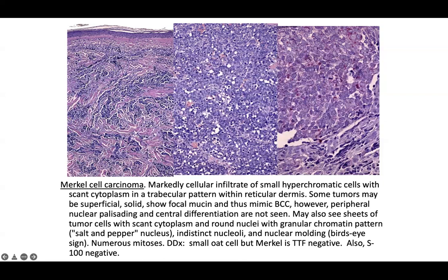You can see mucin, nodular and superficial growth patterns, and some retraction, but classic peripheral palisading is usually absent. If there's any question between basal cell and Merkel cell, do a CK20. I also like BerEP4 or EpCAM because it stains basal cells specifically. Appreciate the sheet-like growth pattern, granular salt-and-pepper chromatin, indistinct nucleoli, nuclear molding, and high mitotic activity — sometimes approaching 100 mitotic figures per square millimeter.